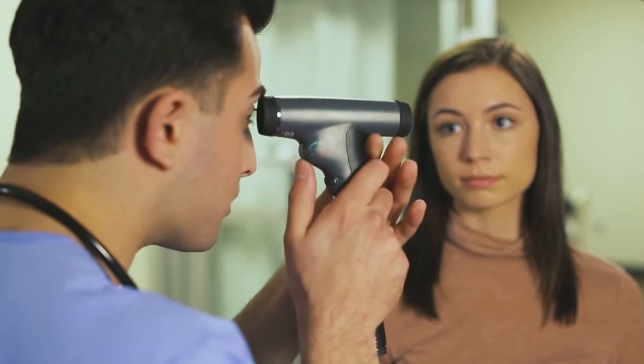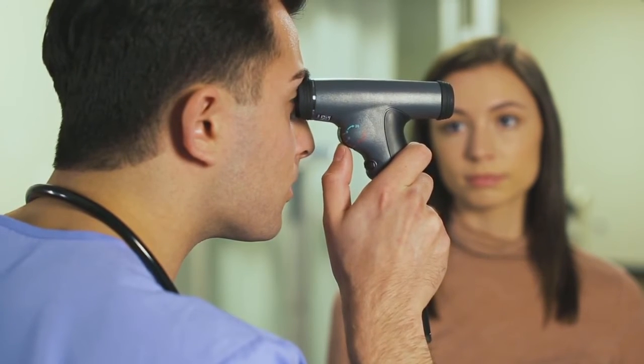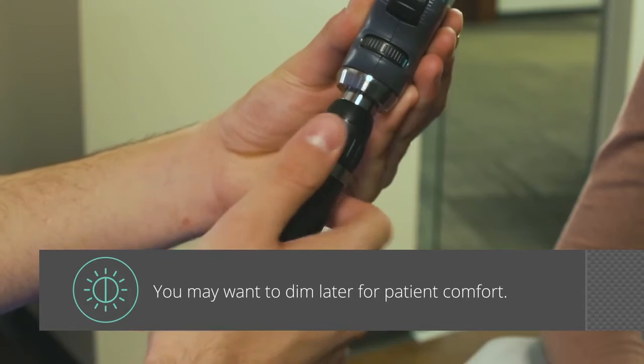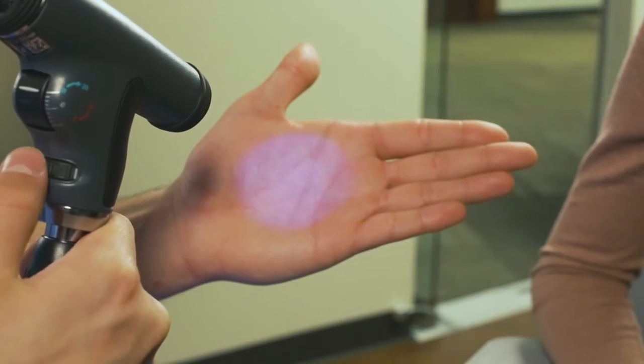To correct for your vision, look through the scope at an object that's about 10 feet away and adjust the focus until it's as clear as possible. Turn the scope on at full intensity — you may want to dim later for patient comfort. Adjust to the appropriate light setting, selecting from different size, shape, or colored filters.